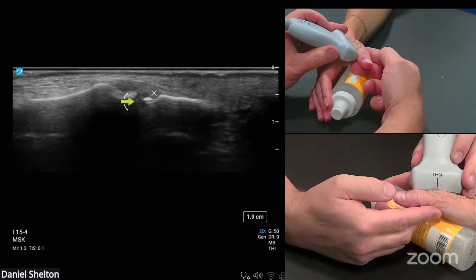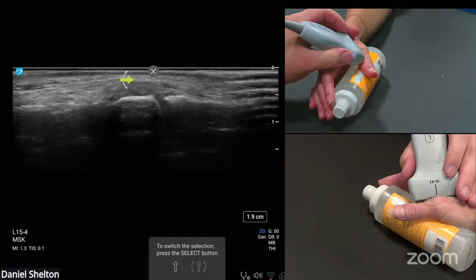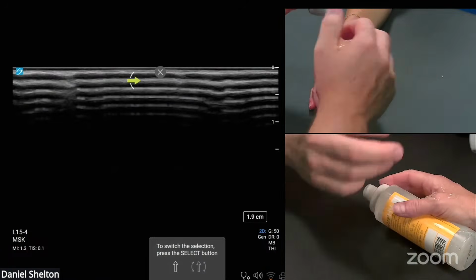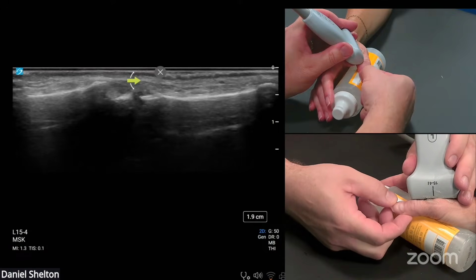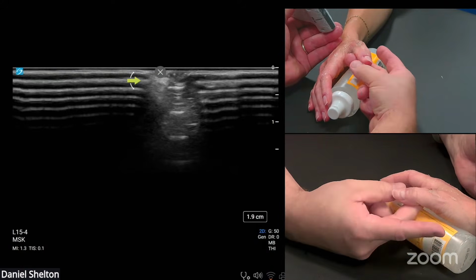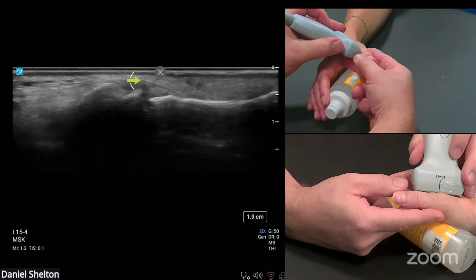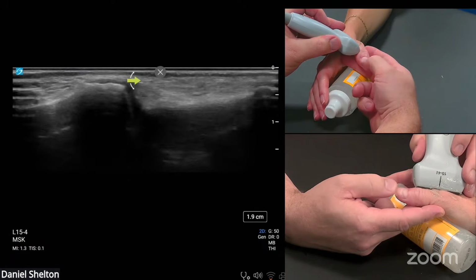And then the other thing that we're going to test is the aponeurosis. And the aponeurosis, which is harder to see on conventional transducers, is this one thin black line right here. And anything in MSK ultrasound, you should make it move. So what we're going to do to make that move, we know that the aponeurosis is connected to the EPL, the extensor pollicis longus as well. So we're going to twitch the thumb distally here. And you can see me pull on that. If you put your fingers in this position here, I've got the ability to twitch the thumb here and to stress the thumb this way, all in one scanning plane. So here I've got stress on the thumb and then up and down with the DIP to check the integrity of the aponeurosis.